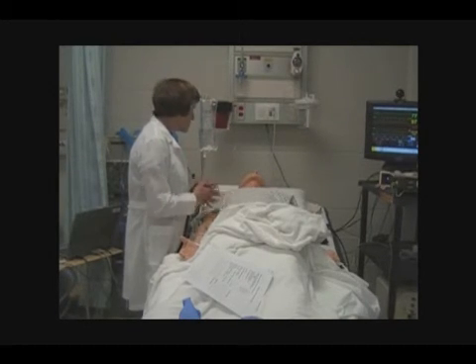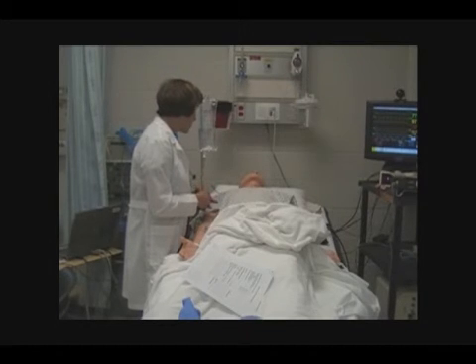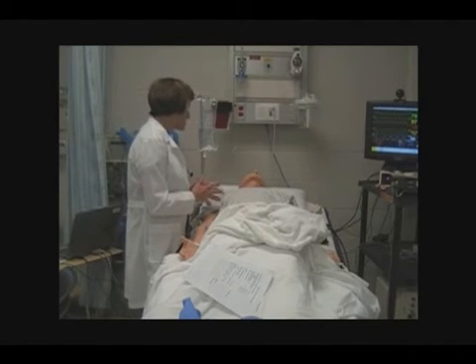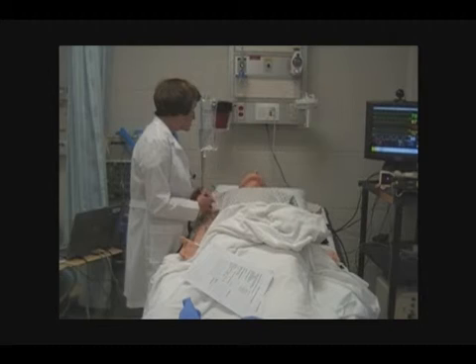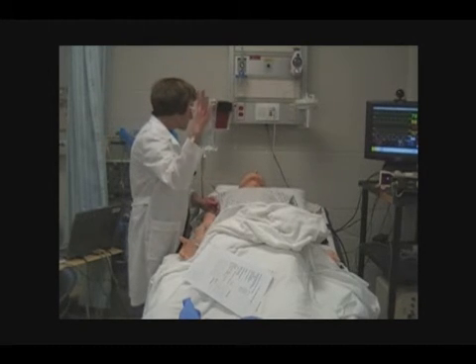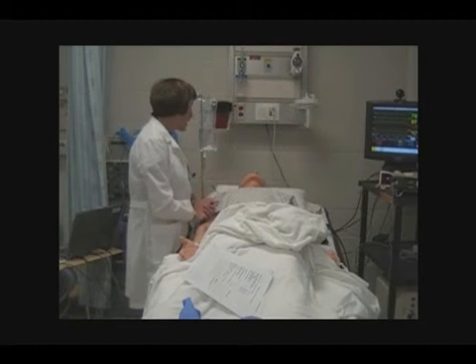You also may have a device called an incentive spirometer that you can do deep breathing on also, that will help you. So let's do one together, okay? So close your mouth and just go deep breathe in your nose. Okay. Every hour we want you to do 10 of those.